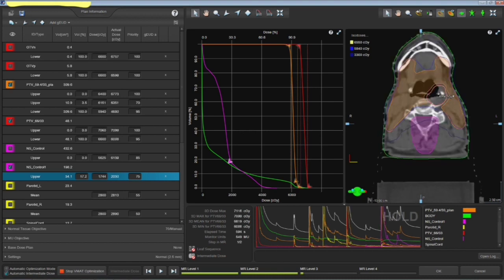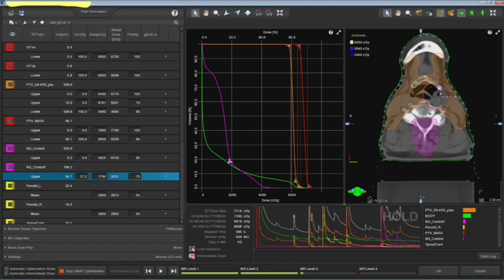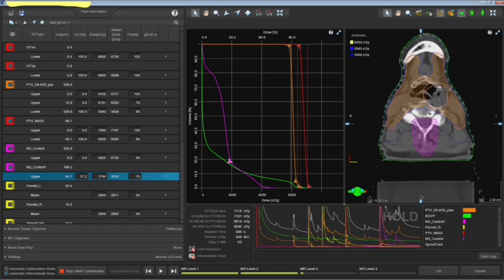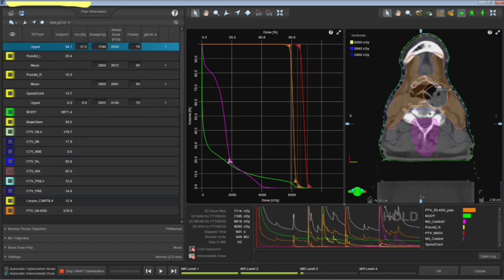And mandible dose is also very important, but as far as now 66 is not going to the mandible if I guess. I think it's only 59.4.